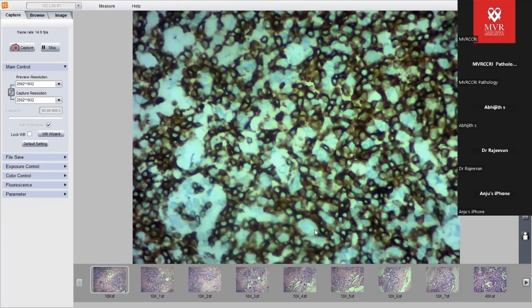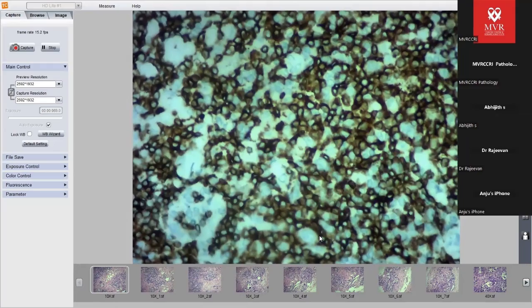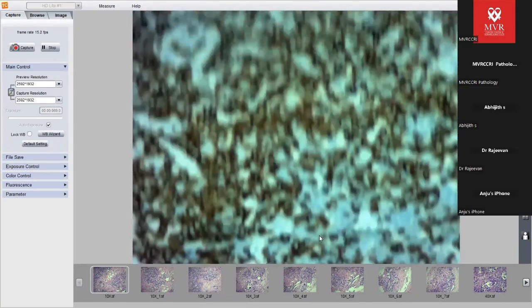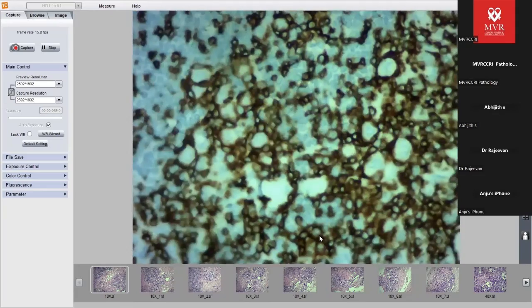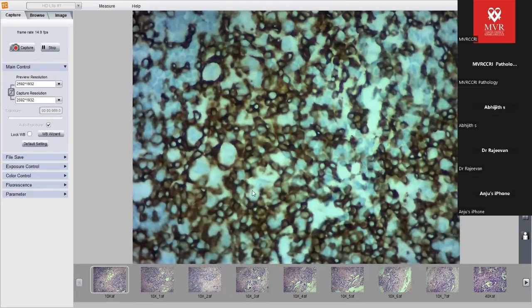Okay, this is a large cell. The counterstain is not very crisp here, but I think you're convinced that this is a large cell. Should I show you something else? Okay, let me see. The counterstain is not very crisp, but this one, I think all of you can make out this large cell. So this is CD3. It is surrounding these large cells.